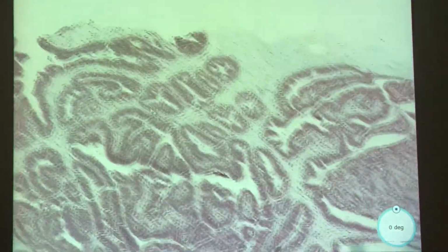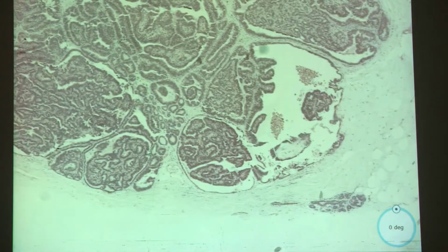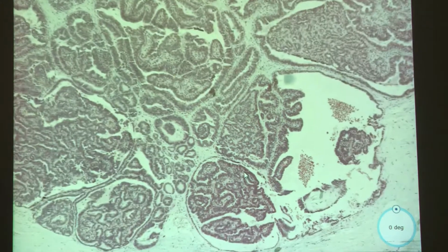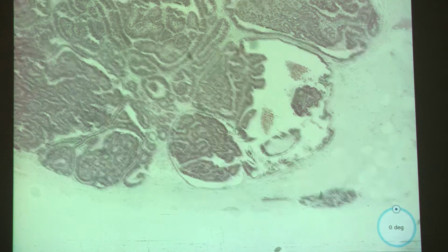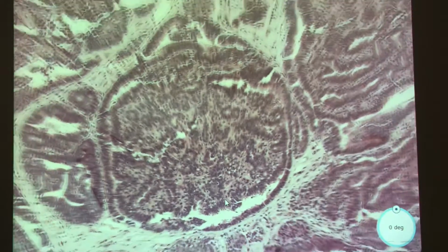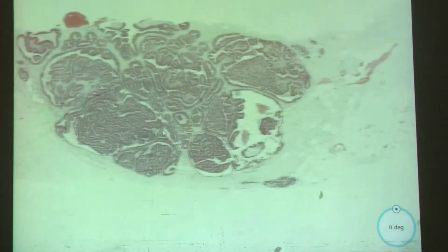All right. But yeah, these are hard. But it seems like the whole lesion looks relatively the same. There's no heterogeneity in terms of local areas of lesion appearance. Sure. So judging from that, let's check out this section, just to be a good pathologist and make sure you scan everything. So this part I'm assuming is just not too exciting, so we're going to pretend we scanned it. Yeah, a little bit of microcysts.